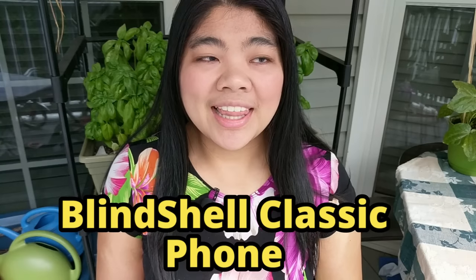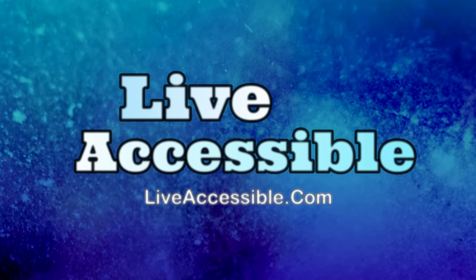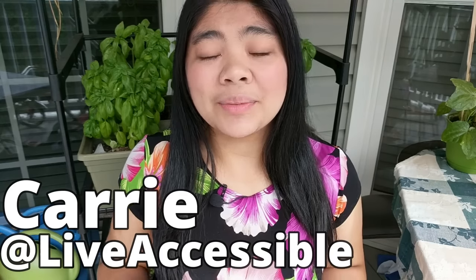In this video, we're going to talk about a phone specifically created for the blind and visually impaired — that's the Blindshell Classic Phone. Today we're going to be talking about the Blindshell Classic Phone, which is specifically made for the blind and visually impaired. It's completely accessible and has auditory and verbal feedback as well as large print. It's really easy to use and a great option for those looking for an easy and accessible solution.